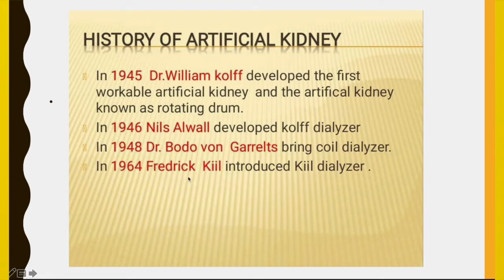In 1964, Frederick Kiil introduced the Kiil dialyzer. So basically this is the history in ascending order. We can see 1940 from Dr. Kolff to 1960 from Frederick Kiil. This is how the dialyzer development occurred.